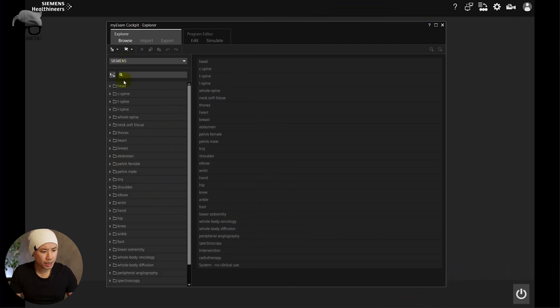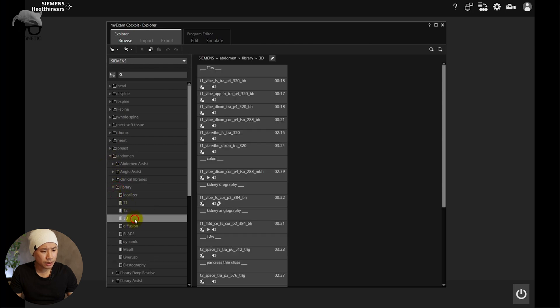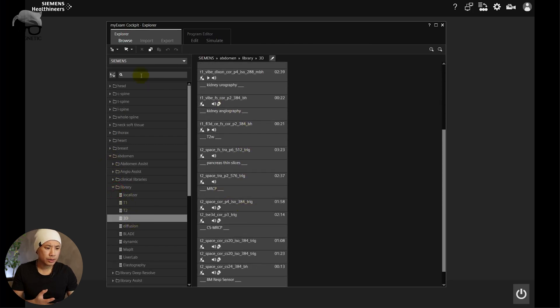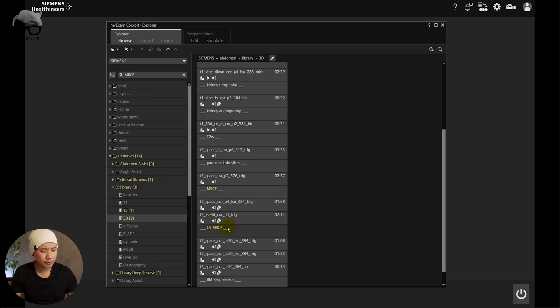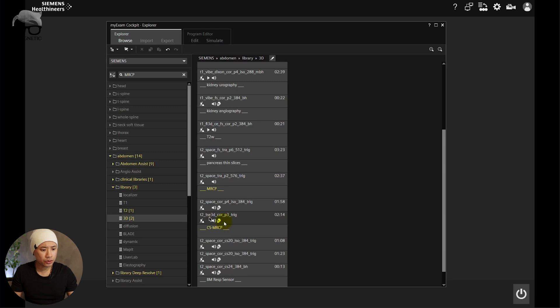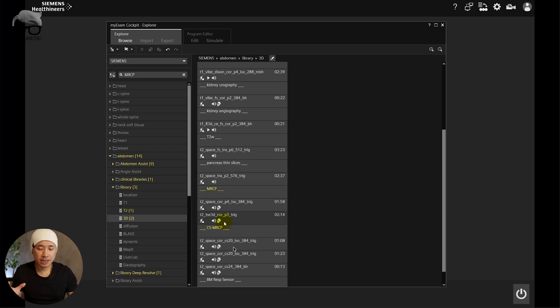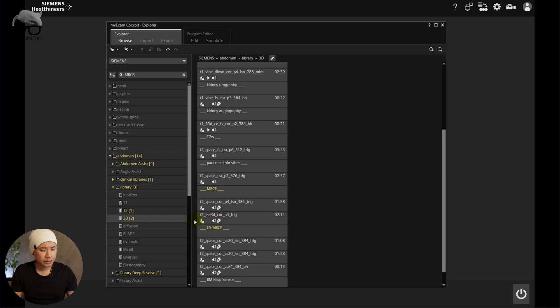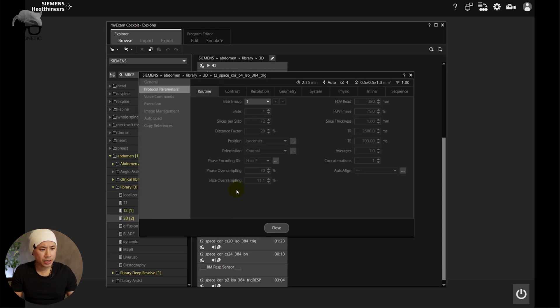All right, we are at the XA70. Go to the Siemens library and locate the MRCP. You can either go to our domain library under 3D, or if it's difficult you can just type MRCP in the search text field and it will highlight those MRCP sequences for you. So you have two — actually three — choices: MRCP with the CAIPIRINHA acceleration mode (the parallel imaging mode), the old-school TSE MRCP, or the 3D SPACE with compressed sensing.